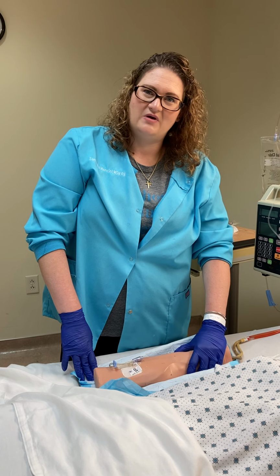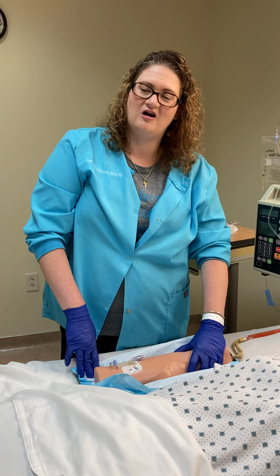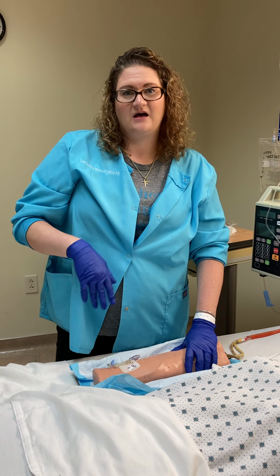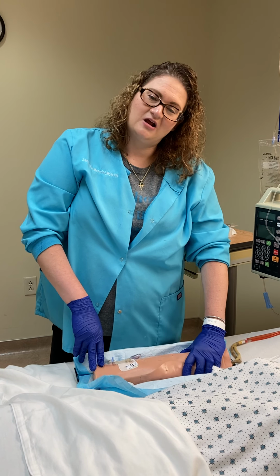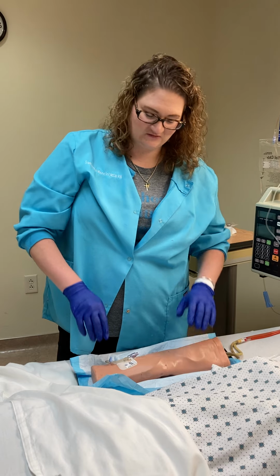Whereas if we're in the middle of med pass and then we determine that we have an IV that's lost, sometimes medications are very time sensitive and they have to be hung within a certain amount of time, or maybe they're refrigerated, and so on and so forth. So checking patency right off the bat is pretty helpful at the beginning of the shift.